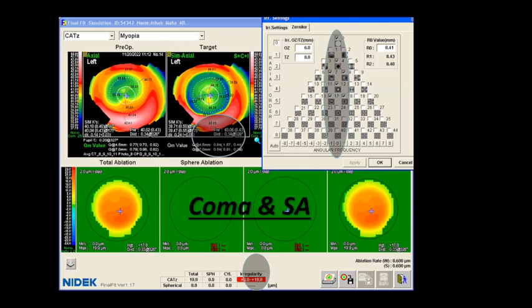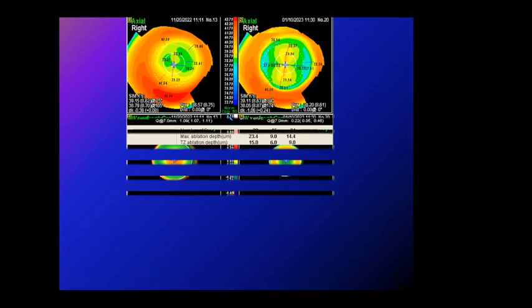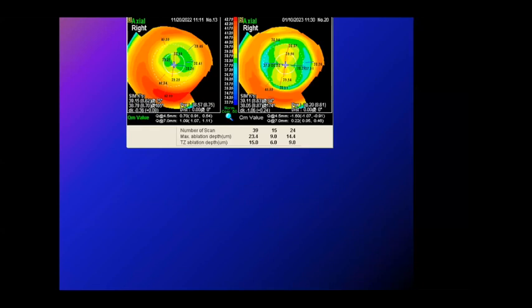Still, we will have more examples. Okay, I hope I'm not bothering. No, we are interested. But there is a question. Is there any simulator in the software so it can show you after treatment how the cornea will look? Yes. And accordingly, you decide to go this way or that way. That's amazing. Do you want me to go back to show you the simulator, or that's it? I already passed on it. Okay, no problem.